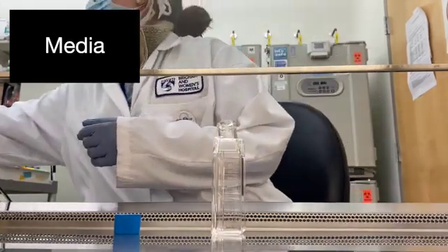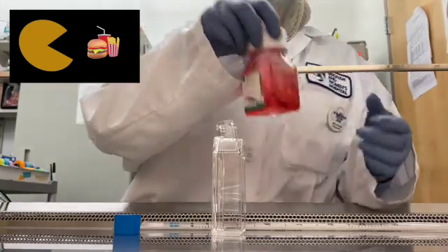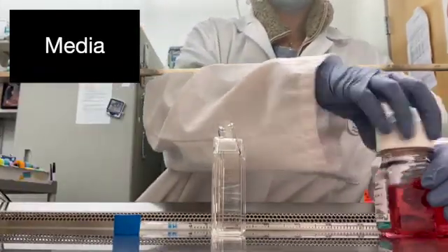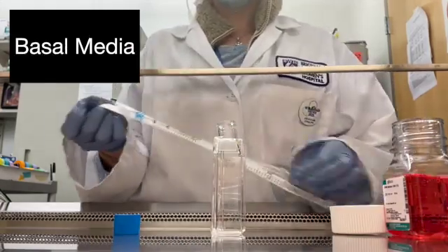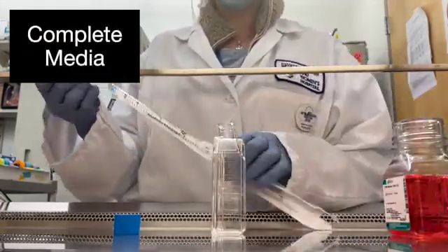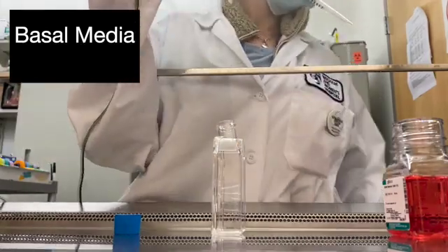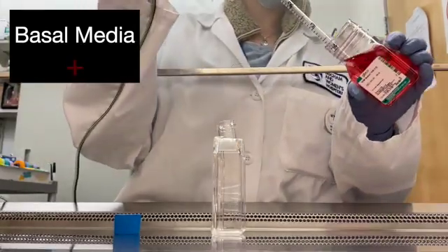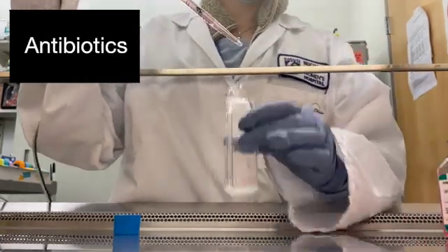Before you add your sample to the culture flask, you need to add media. Media is basically food for the cells. There are lots of different types of media, but in general it helps the cells stay alive and encourages cell division. The two main categories are basal media and complete media. Basal media is plain and doesn't have added nutrients. For hem-onc cytogenetics, we use complete media, which is basal media supplemented with L-glutamine, fetal bovine serum, and antibiotics.